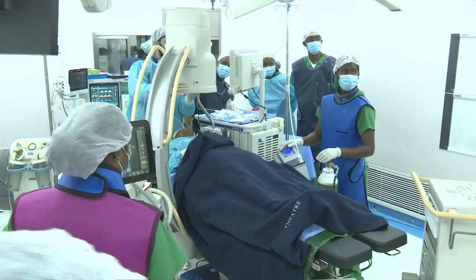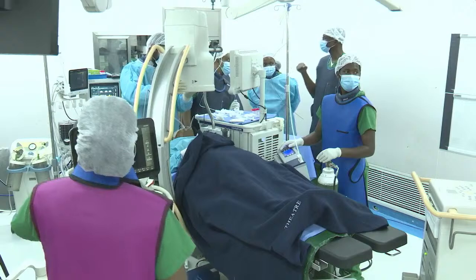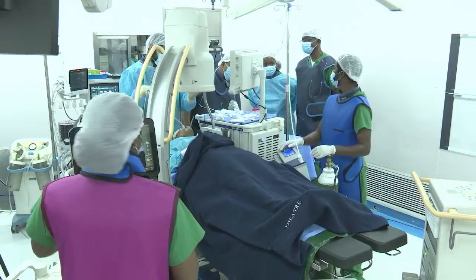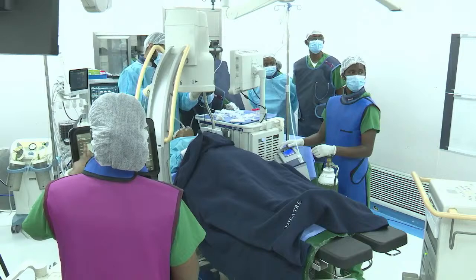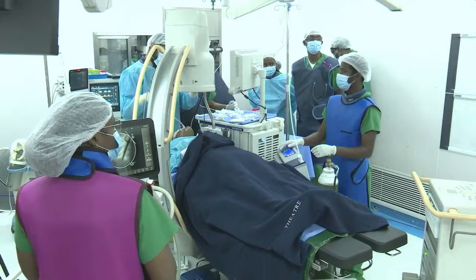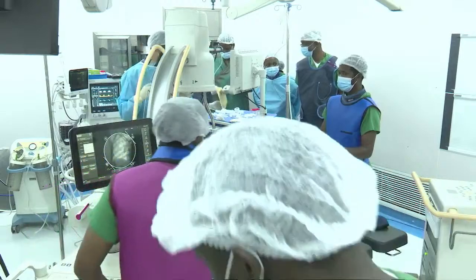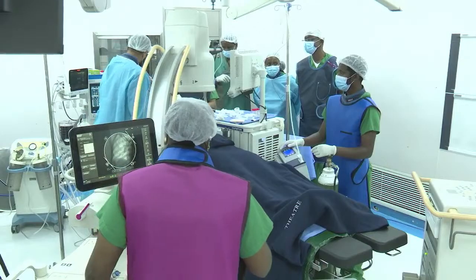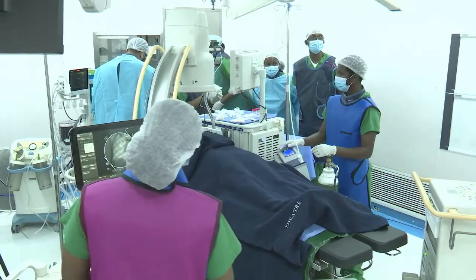That's not so bad. Yeah. Good. Try it again. There, you can see the diaphragm, or you can see the dome rather. Yeah, you can see the angle. That's a good position. You can see the angle, and you can see the marker. Oh, that's my hand on this. Yeah, lock it here. Okay, I think we're good.